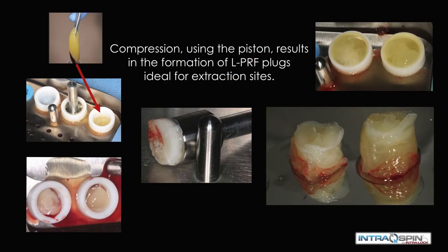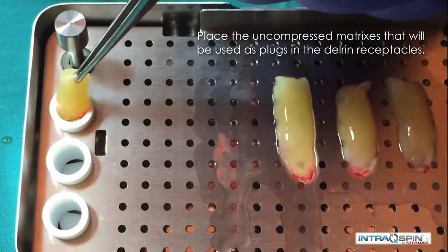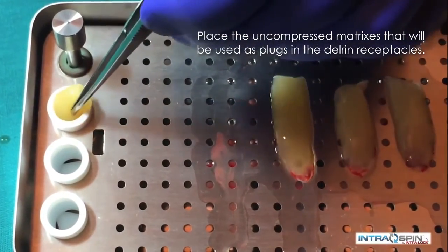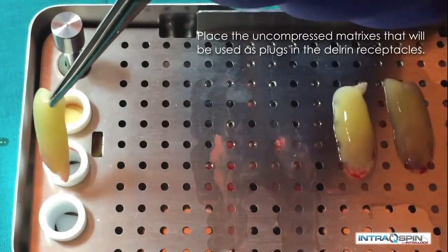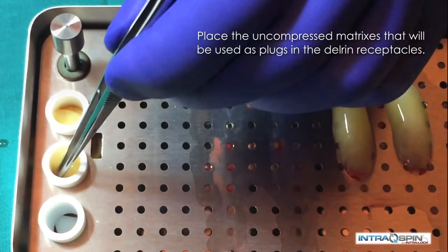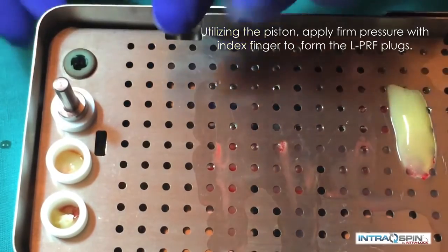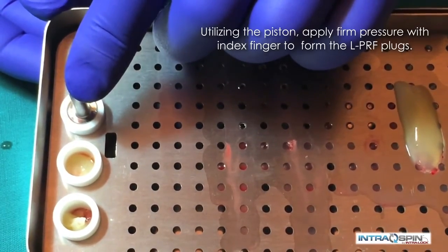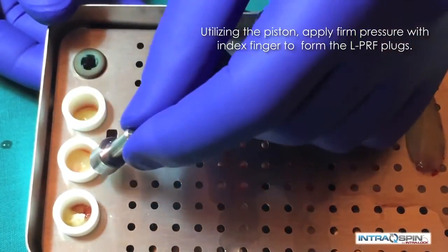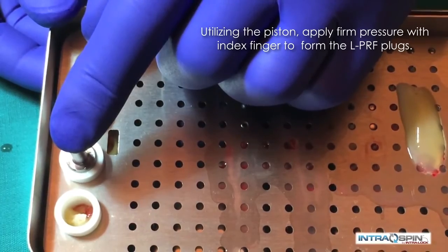There are times when we may prefer to have socket plugs rather than membranes. Here we demonstrate the fabrication of a socket plug. We place the fibrin clots into the delrin cylinder and then compress these clots with the piston assembly. The piston assembly is inverted and placed into the delrin cylinder and compressed until it is even with the top, fabricating very consistent plugs that are suitable for extraction sites.